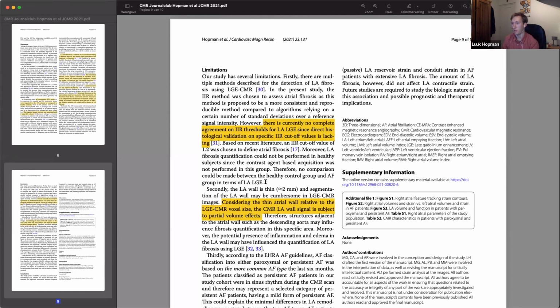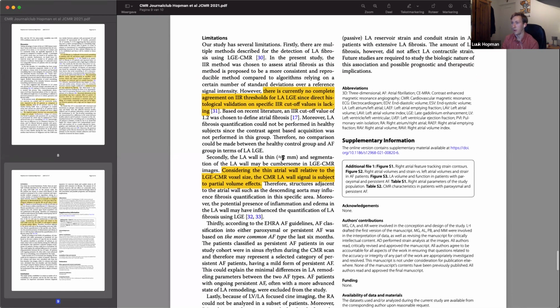So the feature tracking algorithm has some difficulties following the kind of non-existing left atrial wall at those points. So maybe an alternative left atrial strain calculation that is less dependent on following the left atrial wall over time would be beneficial, because sometimes it is quite difficult for the algorithm to follow the left atrial wall. That's my experience, even with other software tools using a different tracking algorithm. It's always the problem with the pulmonary veins, especially if you have heavy inflow artifacts. Then the algorithm usually tracks this inflow phenomenon rather than the atrial wall.